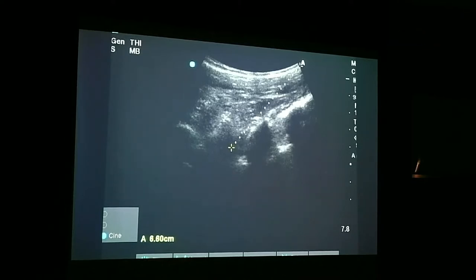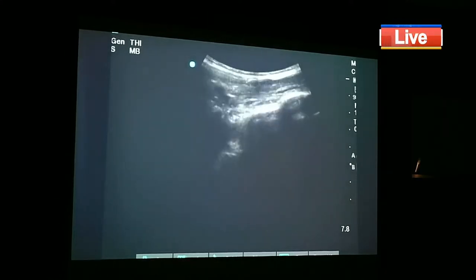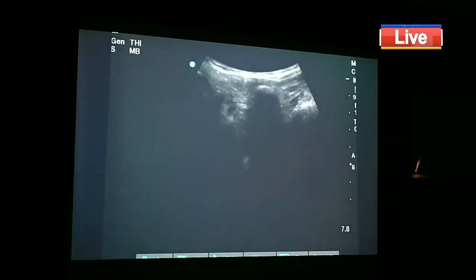Okay. I want to show you the laminar view, so that I can improve this. Until now I showed you the spinous view. Now let me show you the laminar view. So first we'll make the spine view. This is the spine view. You can see the top spines.